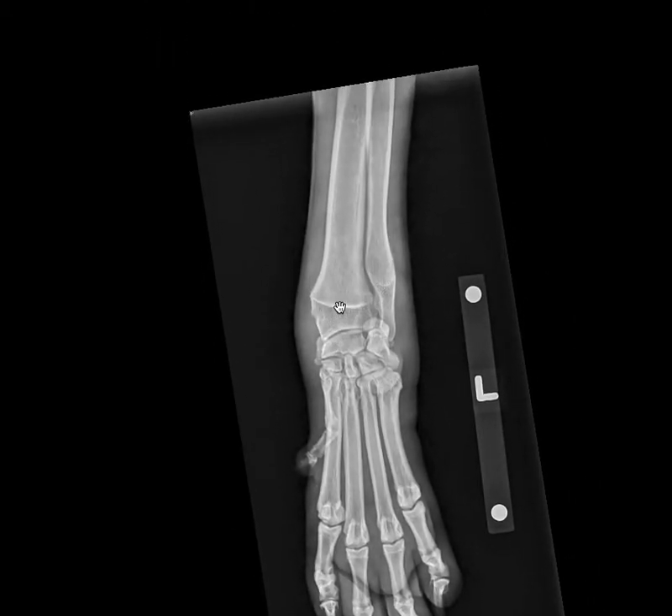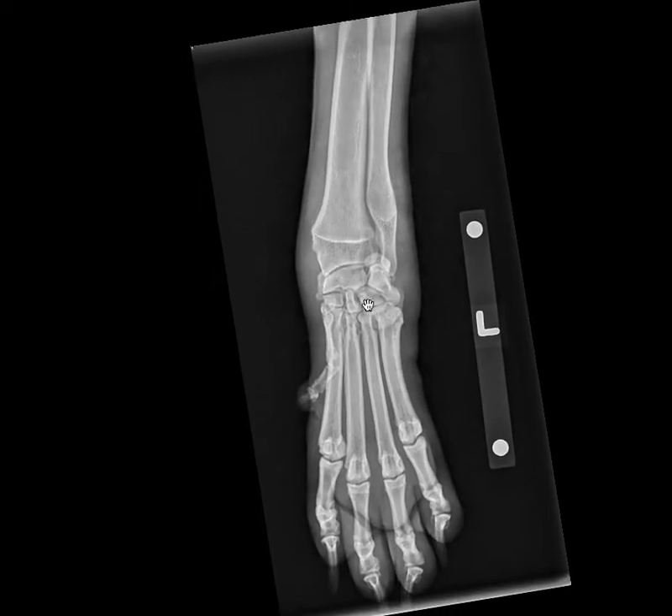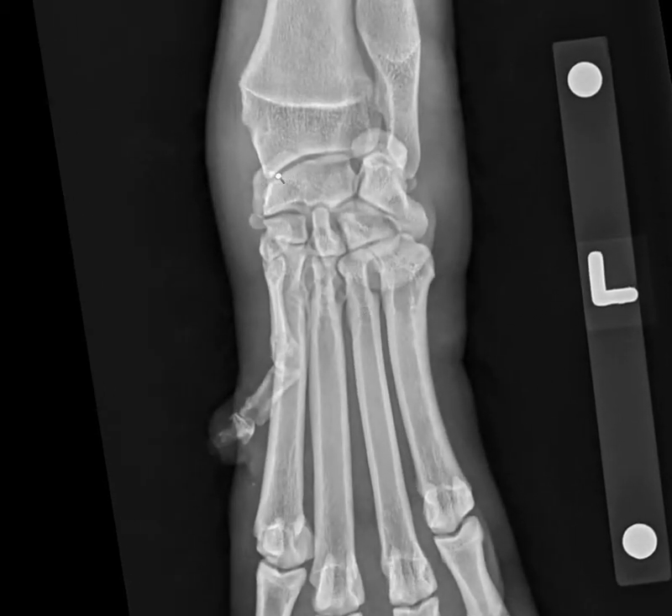Examples of juvenile orthopedic diseases would be things like panosteitis or hypertrophic osteodystrophy. You can see that the physes are appropriately closed for this age of dog. So the next thing — and we practiced this last week — is to look at C for cartilage, which fits nicely into our mnemonic, but what we're really looking at is the radiographic joint space.